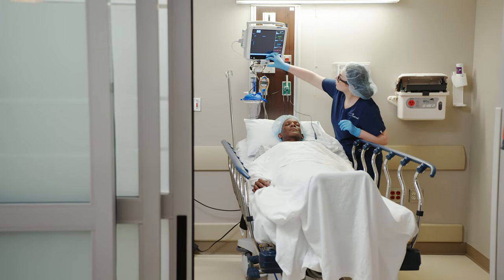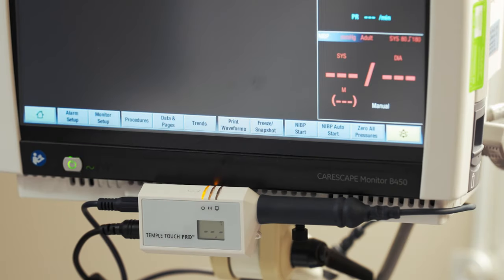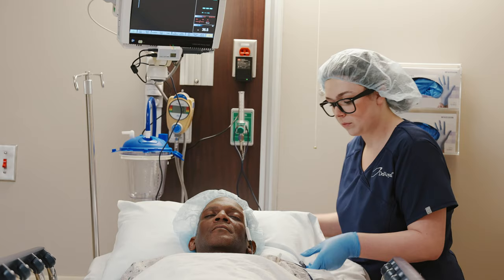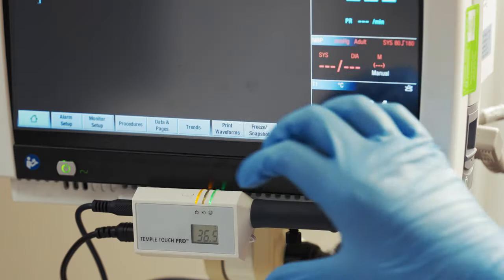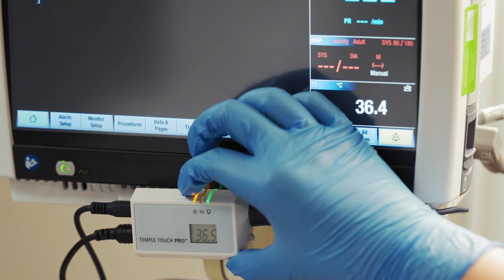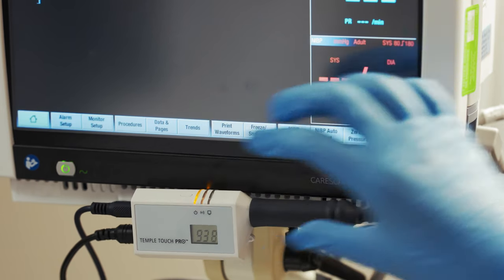When ready to reconnect, confirm the MCU at the new location is already connected to the patient monitor and power supply. Reconnect the cable to the MCU, then restart the MCU by pressing and holding the reset button for three seconds. The patient monitor will display the patient's temperature within three minutes.